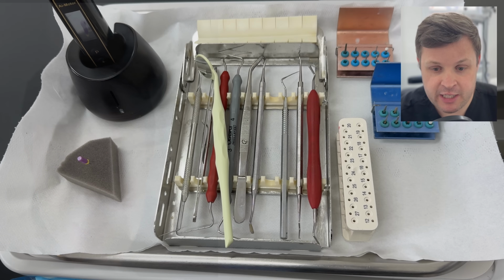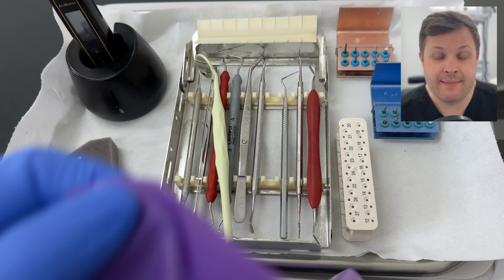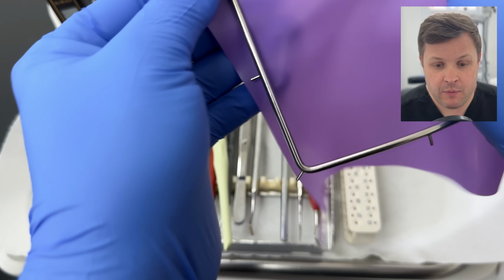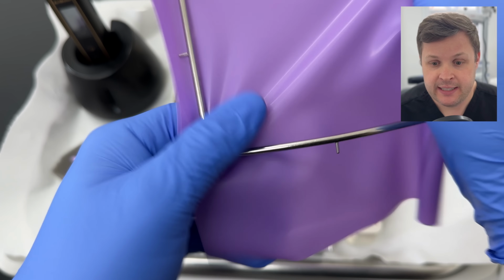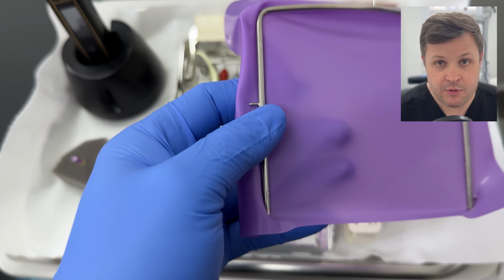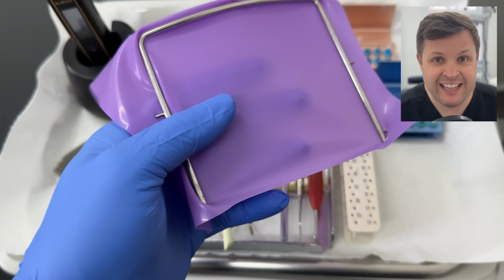If we move over to the video here, we can see that in this case I'm going to do a multi-isolation attempt. The great thing about using multi-isolation is that you get to isolate the tooth, but also, if I was just doing a single isolation, I couldn't replace the filling in an easy way.